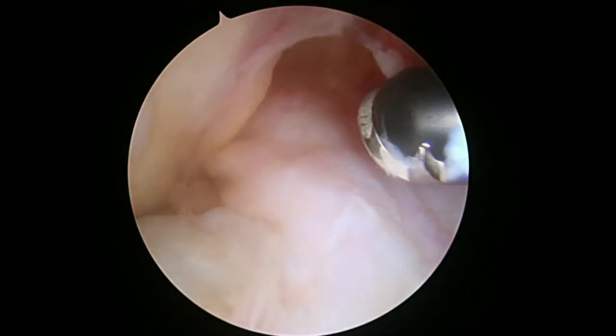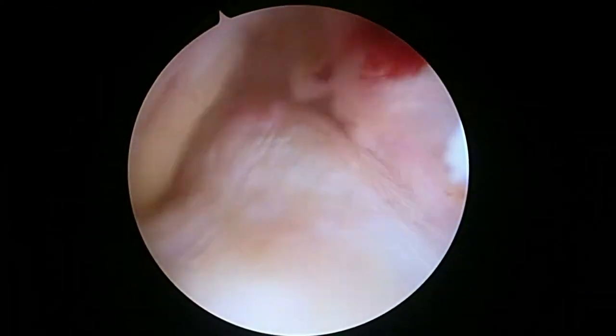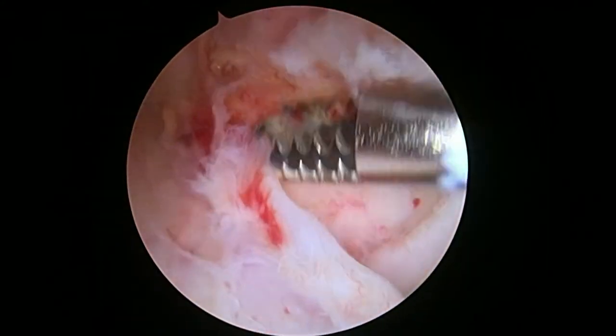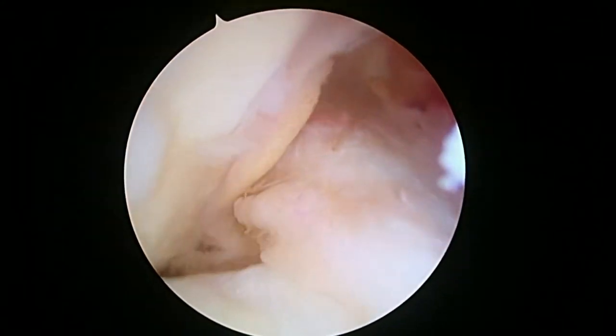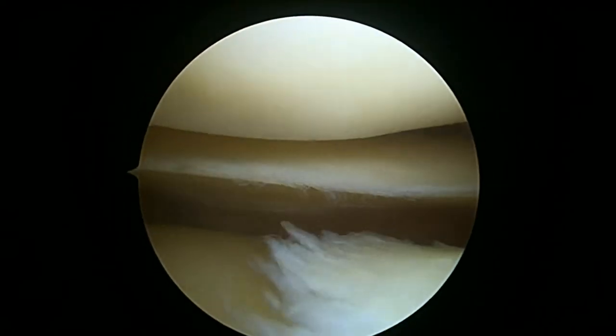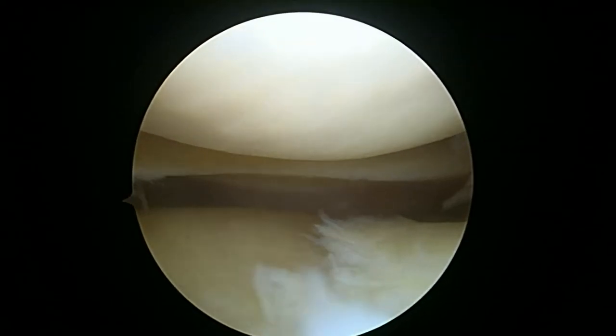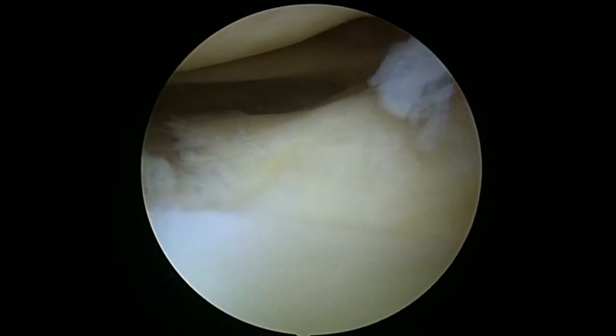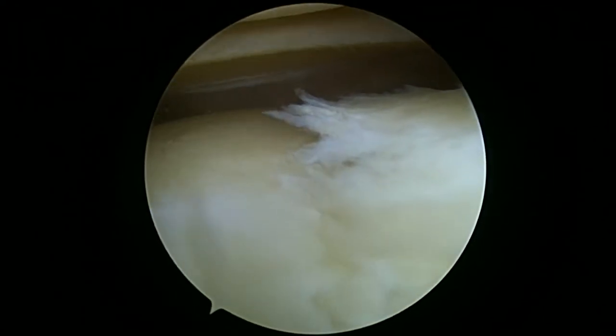Okay, so now we're looking in the central part of the knee. This is the anterior cruciate ligament on the left, and then over here on the right, back behind the shaver, would be the posterior cruciate ligament. Those look fine. We're going to see if we can get into this lateral compartment here. And if you look at the lateral tibial plateau, you can see how that's got some arthritis on it too.